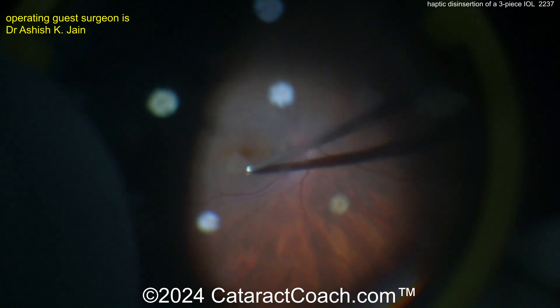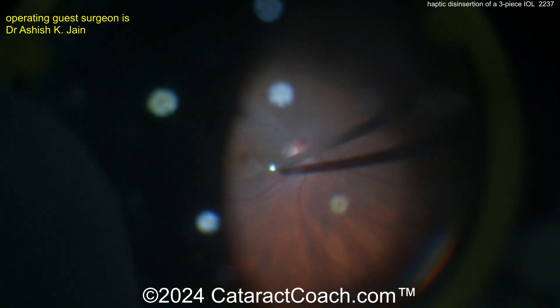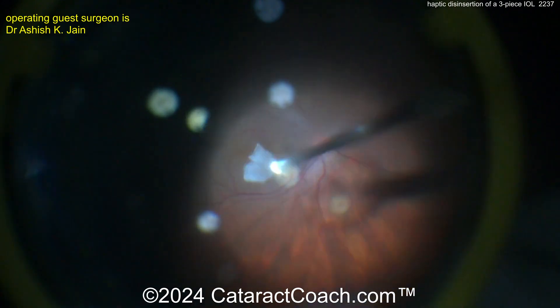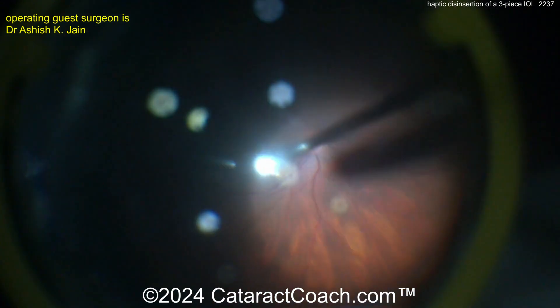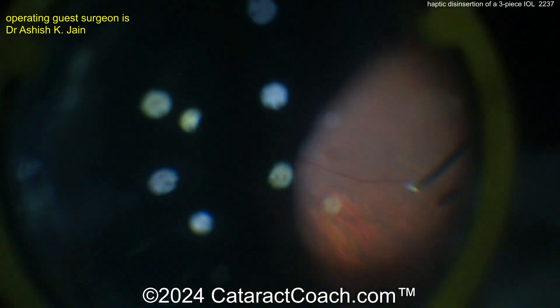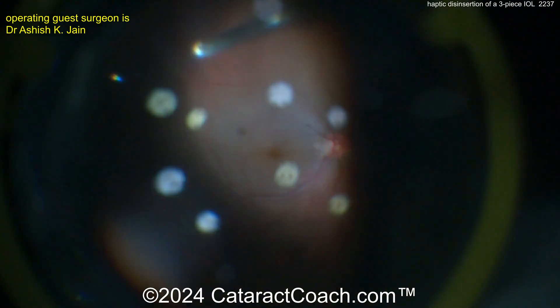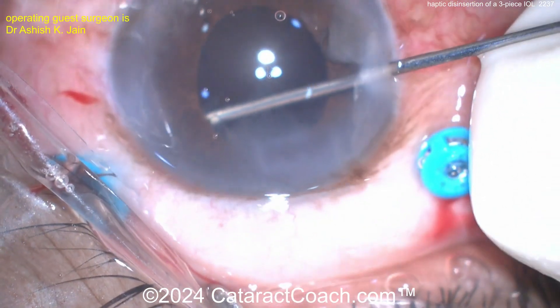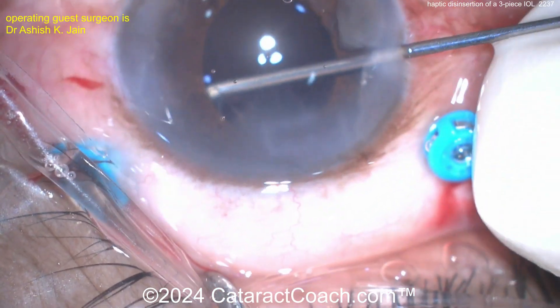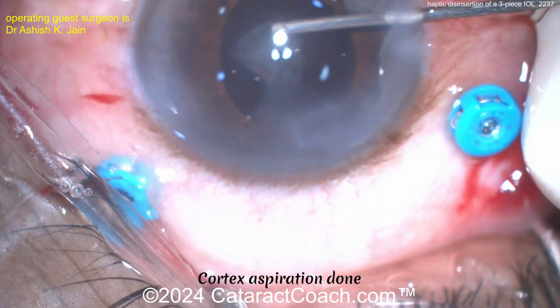Now look how tough this view is. Retina surgeons like this, but us anterior segment surgeons think, gosh, this is such a limited view. But things are cleaning up nicely — core vitrectomy is done, and this patient is going to have a complete vitrectomy here. Now removing cortex.